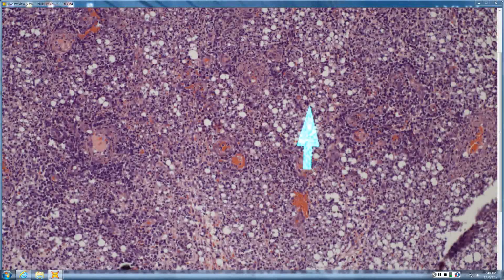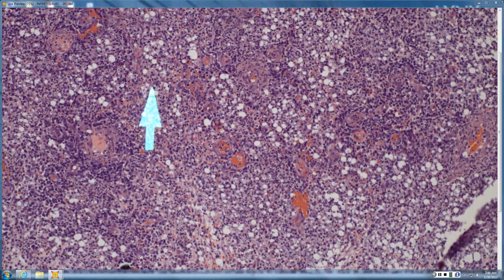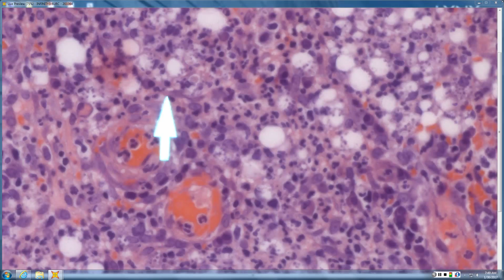So, lots and lots of infiltrate and lots of little vacuoles, pseudo-vacuoles mixed in. Someone hands you a box, what's your first question? Site. Yeah, or what's in the box, right? Someone hands you a slide full of lots of vacuoles, what's your first question? What's in the vacuoles, right? So they hand you a slide full of giant cells or little pockets of pus or circles, you want to know what's in them, right? So let's go higher. What's in the box? What's in the circles?